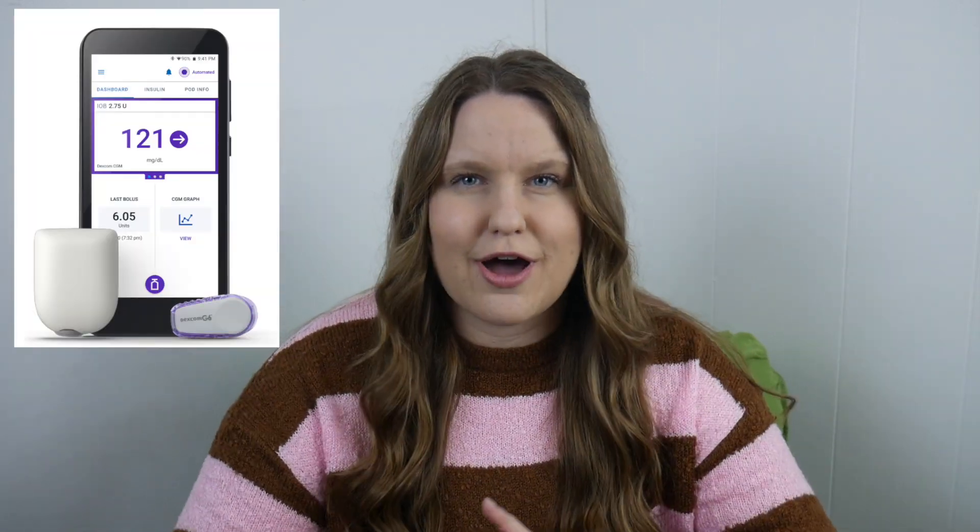What makes the Omnipod unique is that it's a patch pump. It's a pod with insulin in it on your body, so it's tubeless. I've done videos before on Omnipod and Omnipod Dash, but today — Omnipod 5.